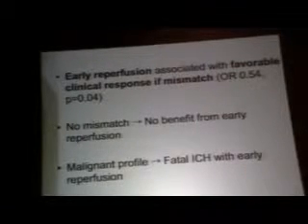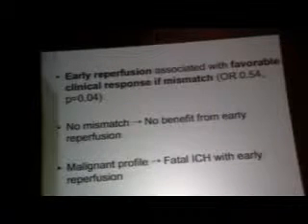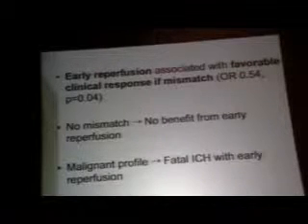If there's no mismatch, there's no benefit from early reperfusion, given this from the DEFUSE study. And the malignant profile, which means a diffusion lesion of 100 cc's or more, is associated with fatal ICH with early reperfusion. So these patients should be avoided.